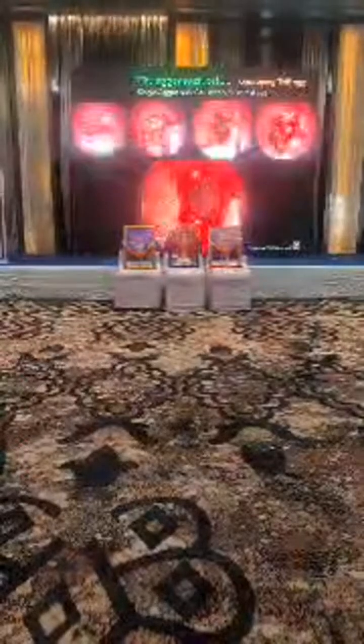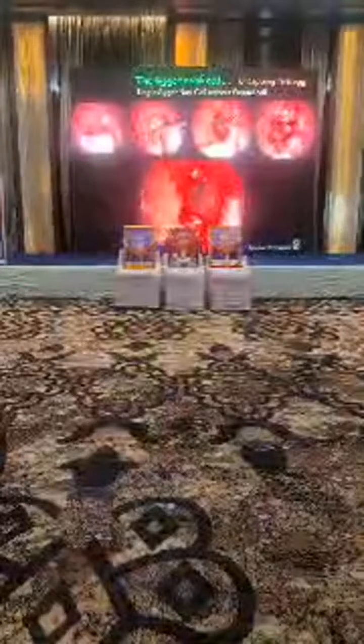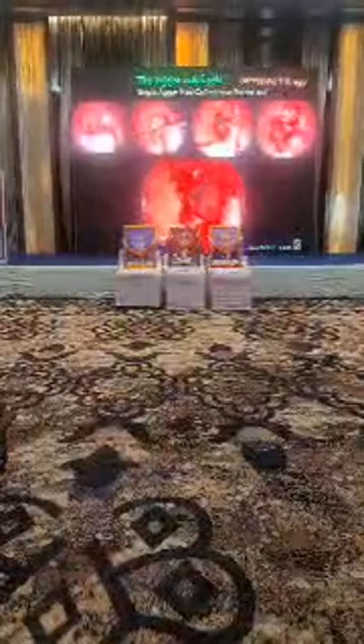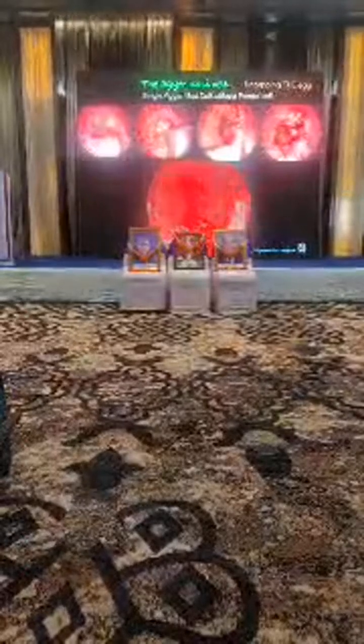Right? This is a simple configuration. This is the agger cell. It is uncapping of the agger. Only an agger cell is there. The images show the dissection of the agger cell. And once you remove this extra wall of the agger cell, directly you are visualizing the frontal sinus. This is the frontal sinus flow.